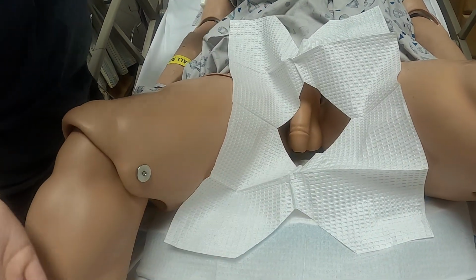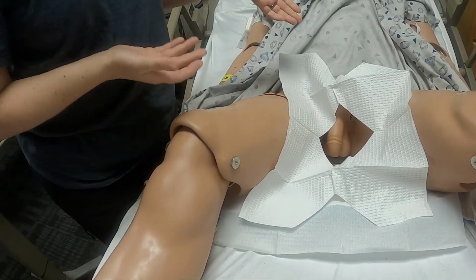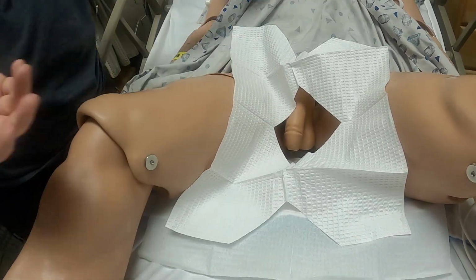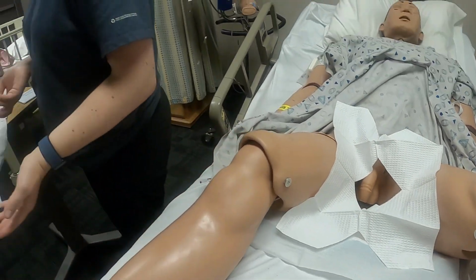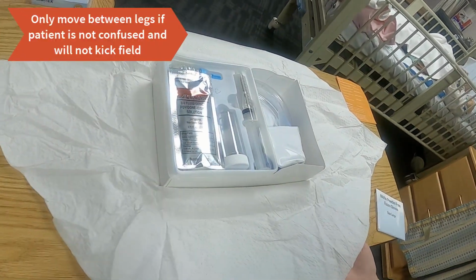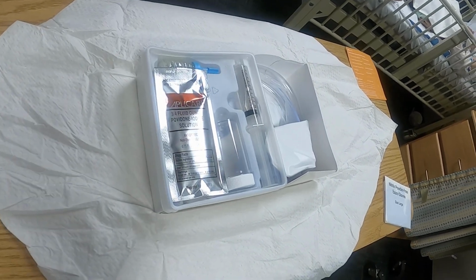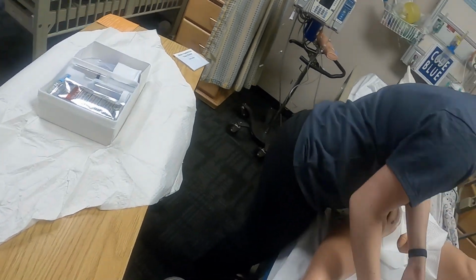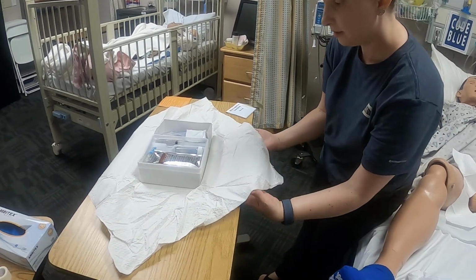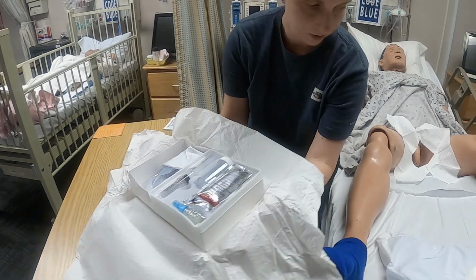So as I said, you can attempt to put it on. That is really all you need to do, especially since he's a male, right? How does this provide you extra coverage? It helps with the thighs, really. Okay, all right, there you go. To move my field, if I know that he's not going to kick and do anything, you can move your field over in between his legs. To do that, you go underneath and move your whole field over. There you go.